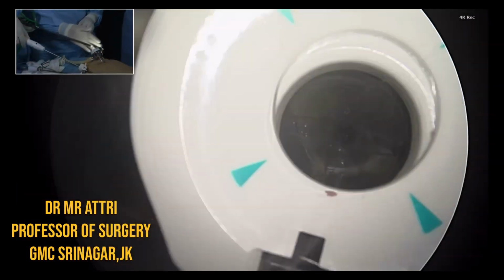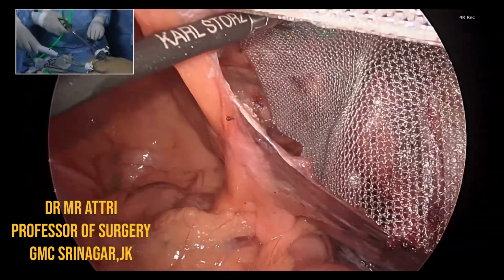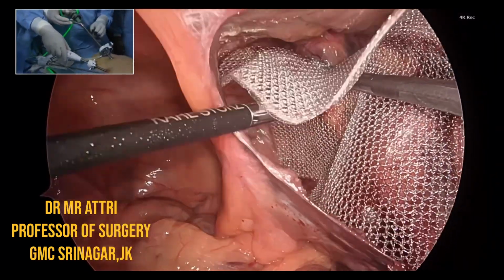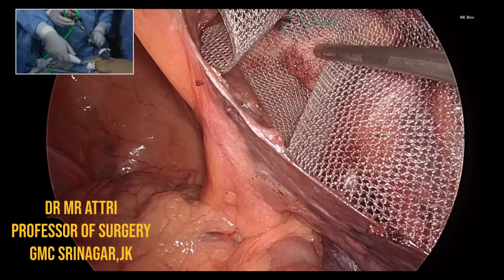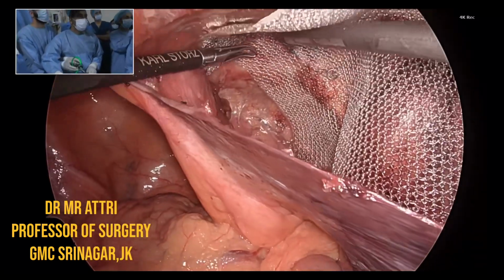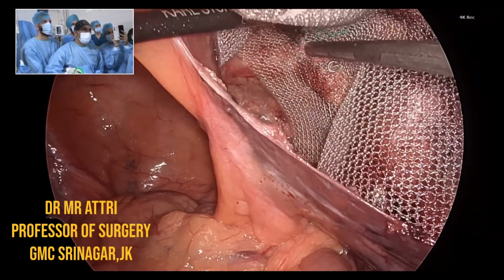Just see how it goes. We'll be fixing the mesh. Just see, it has been applied. I'll be fixing one more here.